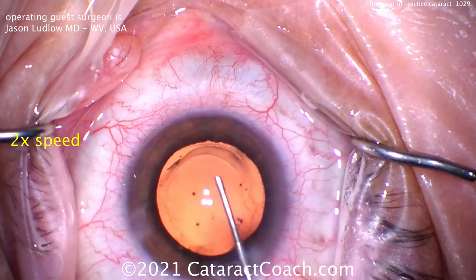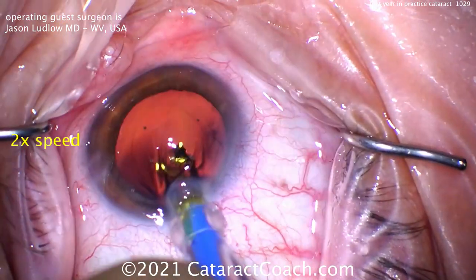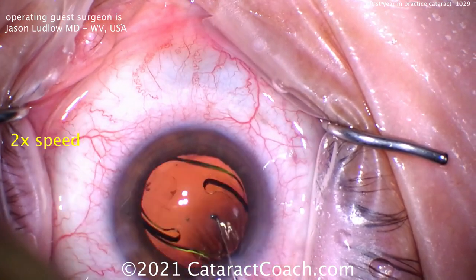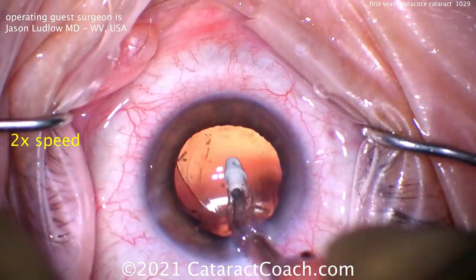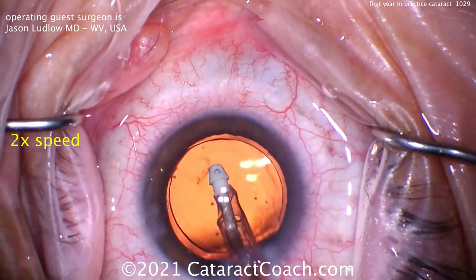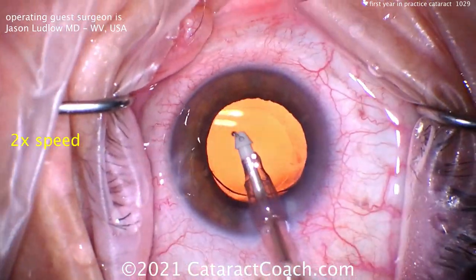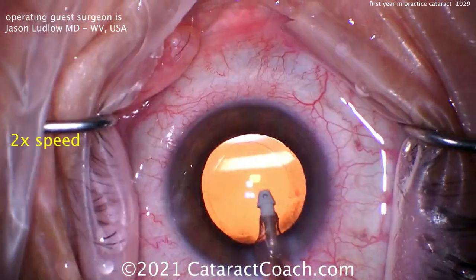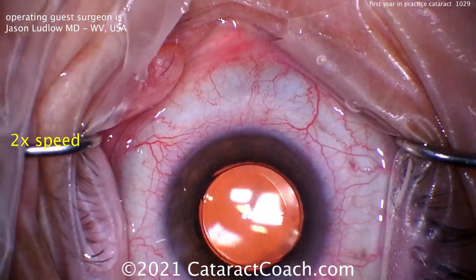Can't hardly wait to see what lens we put in. Filling the eye with the cohesive viscoelastic — and by the way, this is my first time watching the video too, so it's a fresh view for me. Here comes the lens, a single-piece acrylic going into the eye. That looks great. The technician did a good job loading the lens and it's in good position. I like moving the lens so the haptics are at 12 and 6, allowing easier access to get under the lens and remove the viscoelastic. Remember, particularly if you're doing a toric or presbyopic lens, you want the lens to be in direct contact with the posterior capsule. Beautiful overlap of the optic by the capsulorhexis.